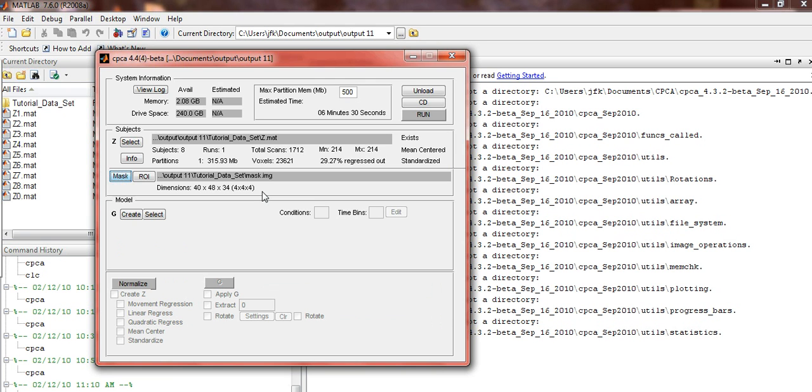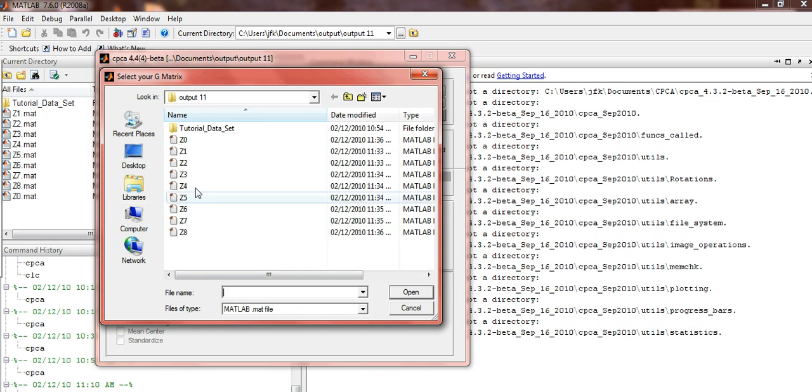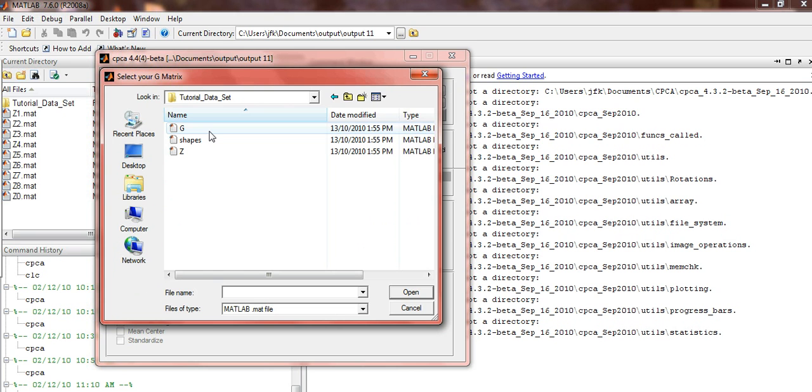Now you're ready to select a G. Click on the Select button under the Model panel, open the Tutorial Dataset, and open G.